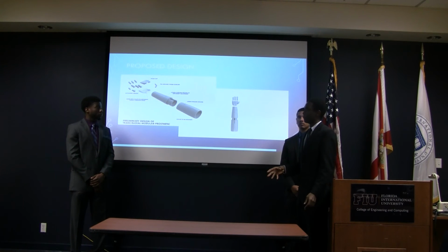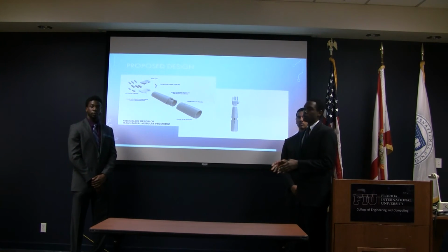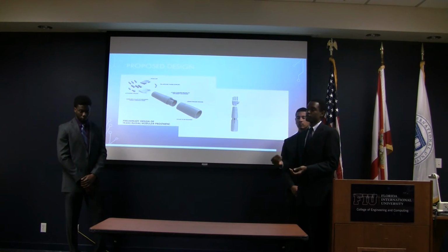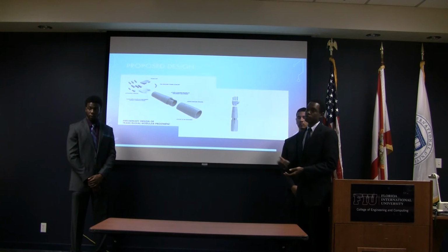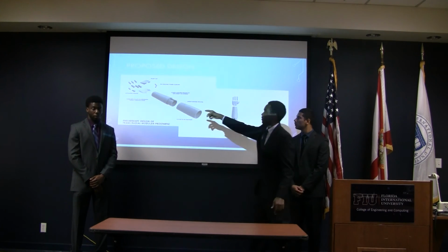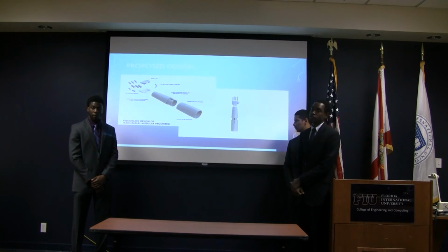What we want to do is delve into a myoelectric type of prosthetic. What that means is that it will be driven electrically by taking signals from the residual limb and driving DC motors. So we want to add DC motors into the cavity of the hand, which will drive the fingers.